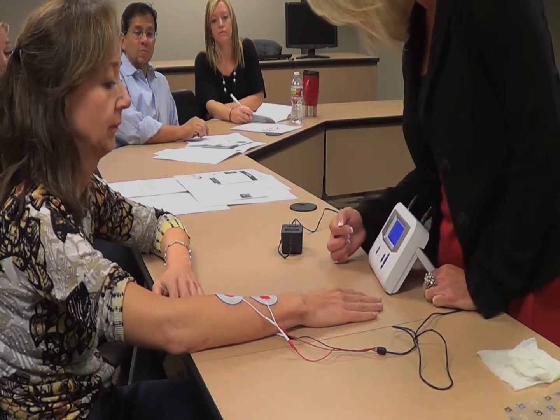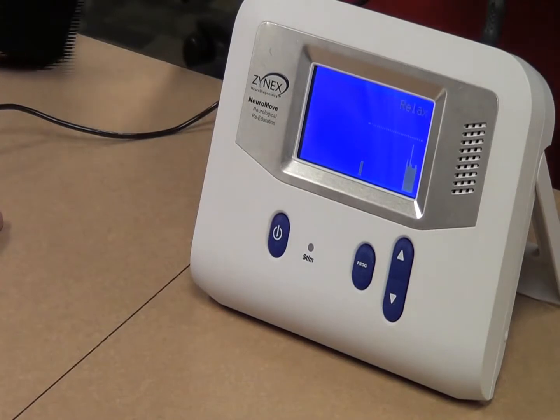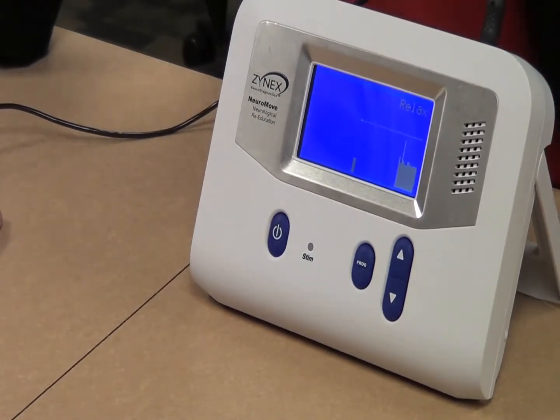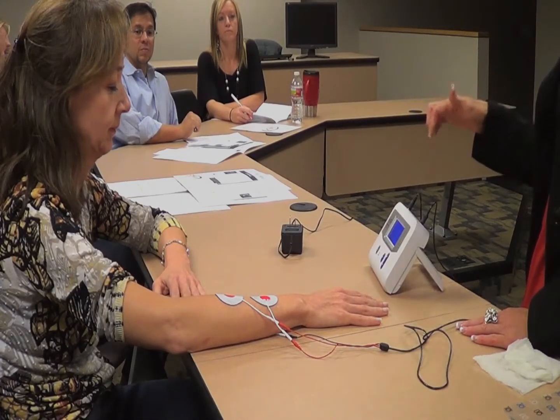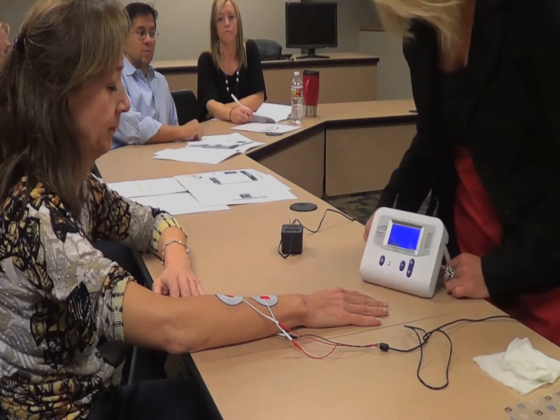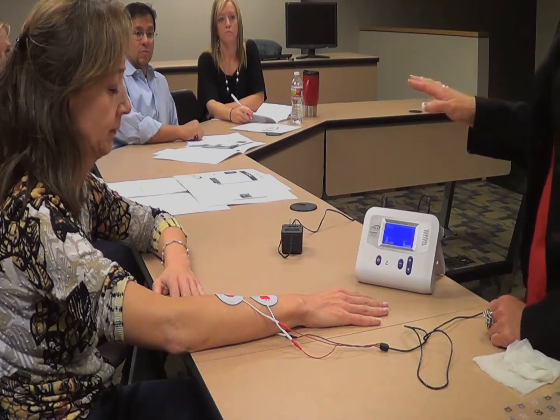Okay, so if you hit the program button again, we want her to relax. So right now, I just want you to focus on your breathing in and out. Put everything out of your mind. We want to get your background muscle noise nice and level on the screen. Ready. Even though it's in ready, I don't want you to start thinking about anything yet.